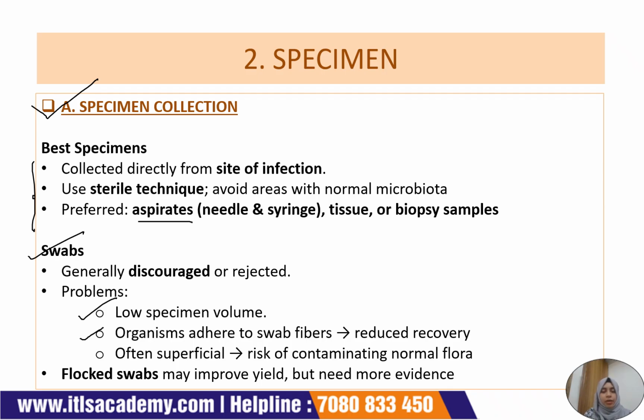Okay, and they are often considered superficial because they increase the contaminating normal flora. Now the last point is flocked swabs may improve yield. That means they are considered in the laboratory, but their evidence is reported at very low scale.